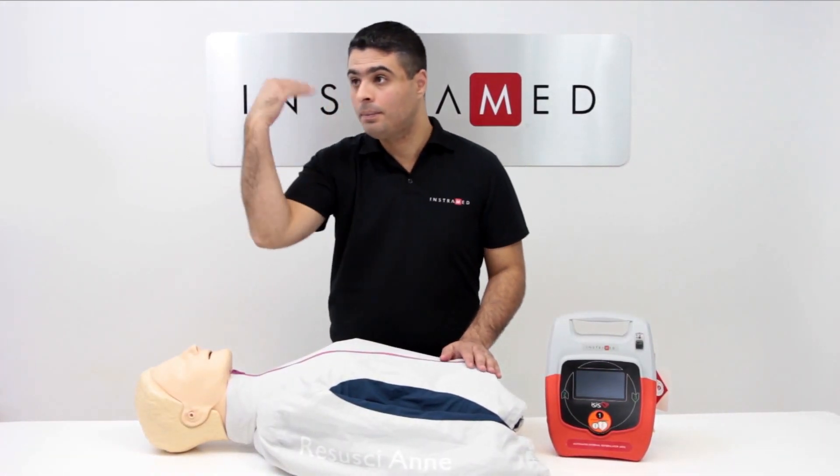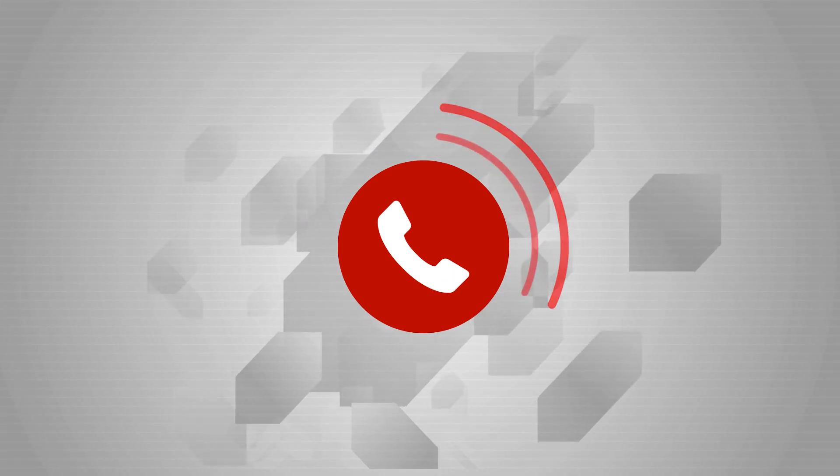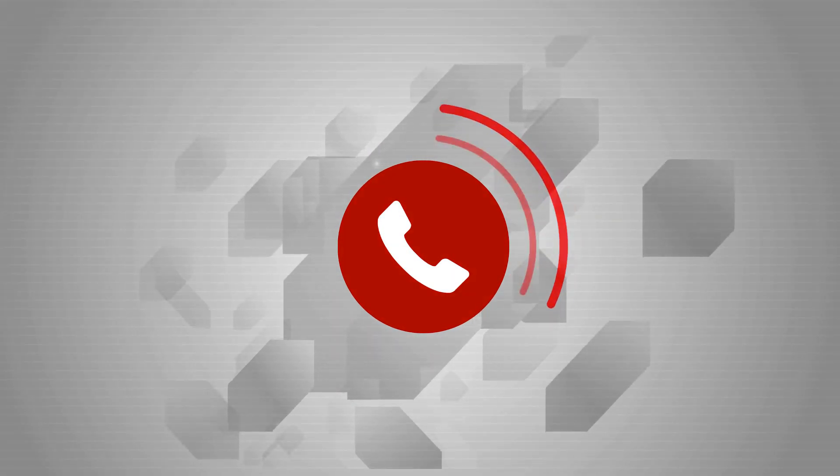Call for emergency assistance before beginning to use the device. If someone is with you, ask them to make the call while you proceed to immediately treat the patient.